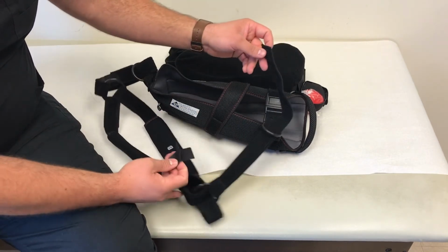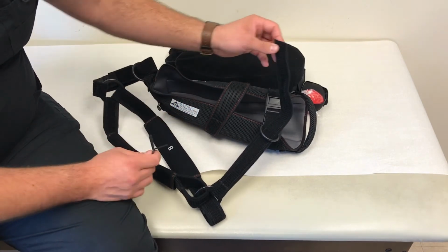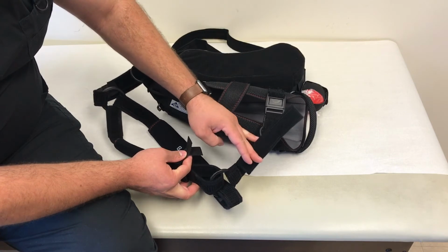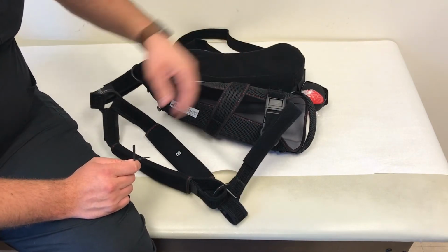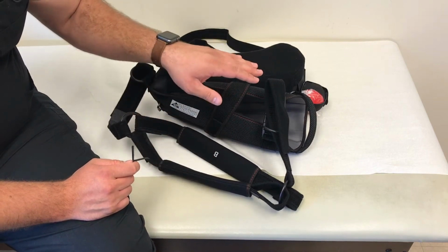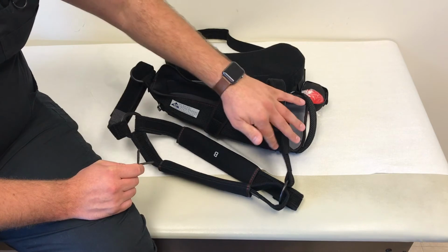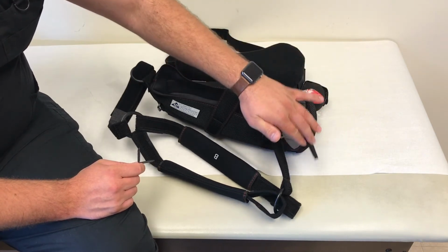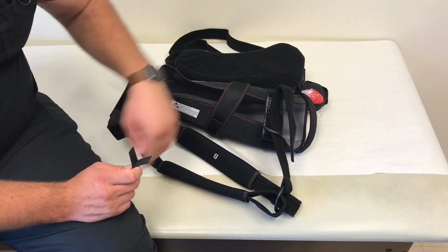And what I recommend is once you have the sling on and you're all set up just like this, you can go ahead and adjust the length of the sling. I recommend doing all straps first. I should say do all straps equally. Don't just make the A strap as short as possible and leave B, C, and D alone.